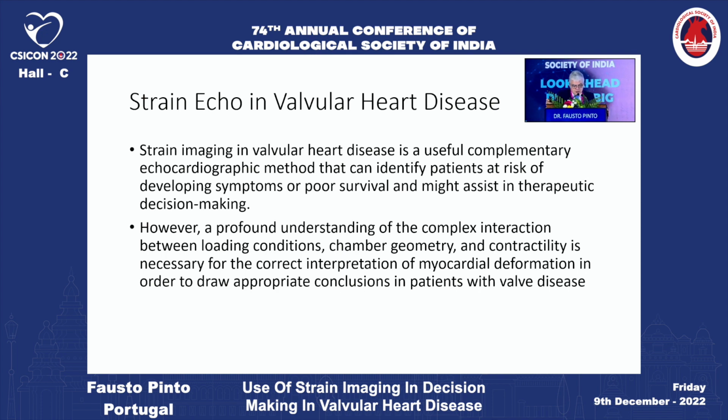And again, the conclusion also is that it's important we improve our understanding of the complex interaction between, for instance, loading conditions, which we know affect this type of parameters. They are load dependent, chamber geometry, and contractility, which is necessary for the better interpretation of myocardial deformation in order to draw appropriate conclusions in patients with valve disease.